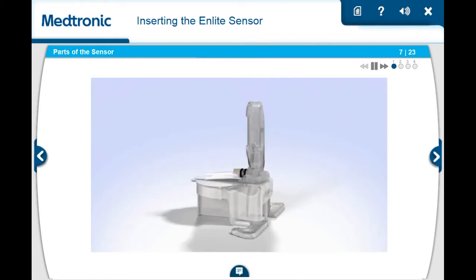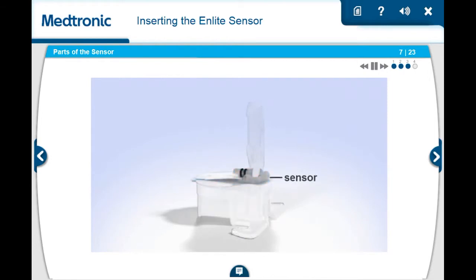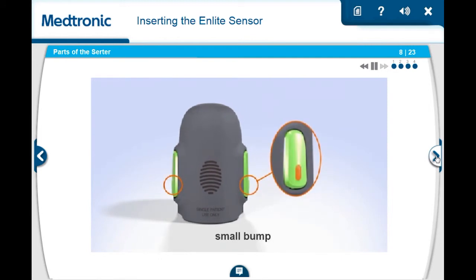Let's take a closer look at the nLite sensor. Your nLite sensor comes attached to a plastic pedestal. The pedestal keeps the sensor in place while loading the serter. The sensor lies on top of the pedestal and is attached by an adhesive pad. On the top of the sensor is the needle housing, which holds the needle in place. Now, let's take a closer look at the serter. The serter has a thumbprint marking on one side, where you will hold the serter while loading the sensor. On either side of the serter are two large green buttons. Each button has a small bump that you will press to insert the sensor into your body.